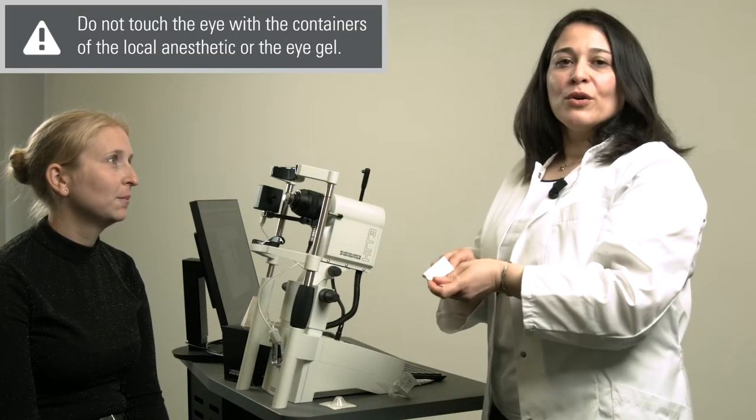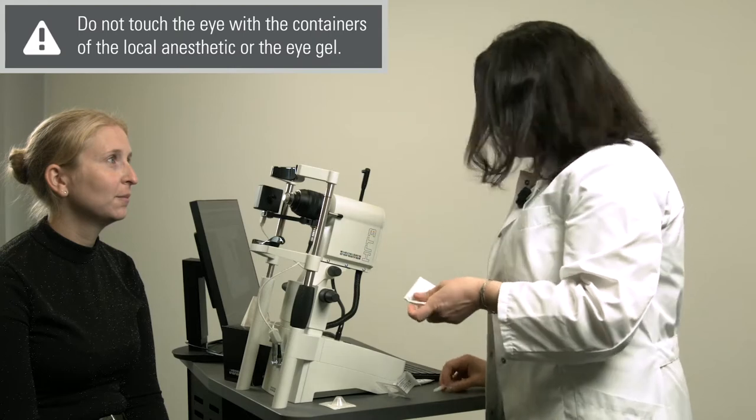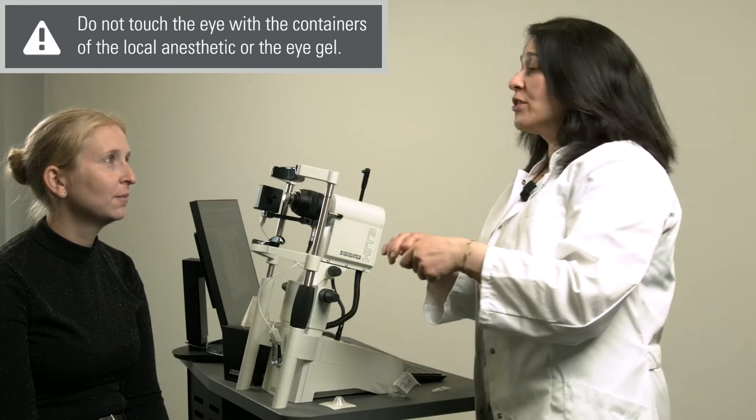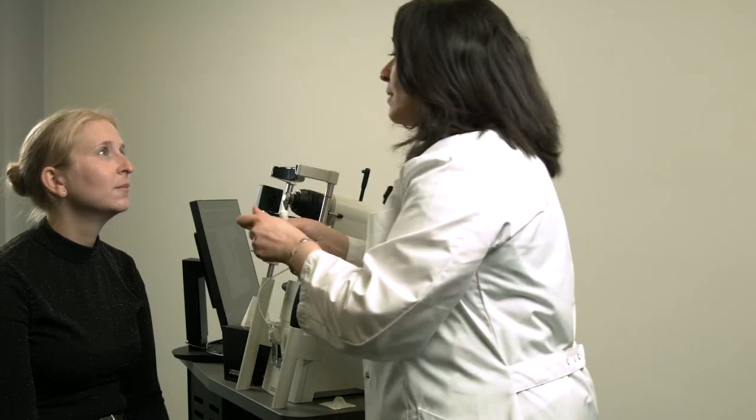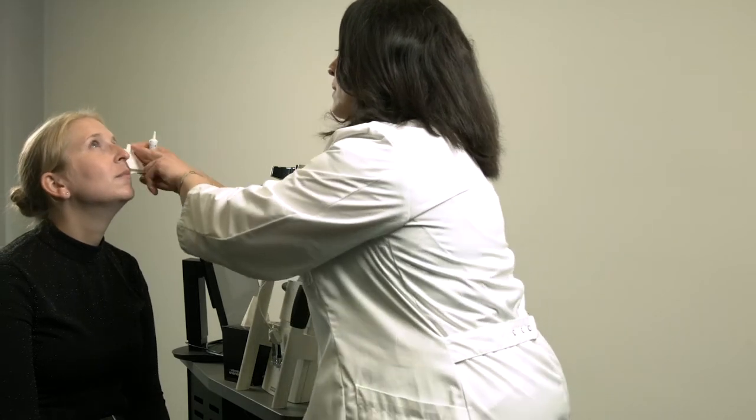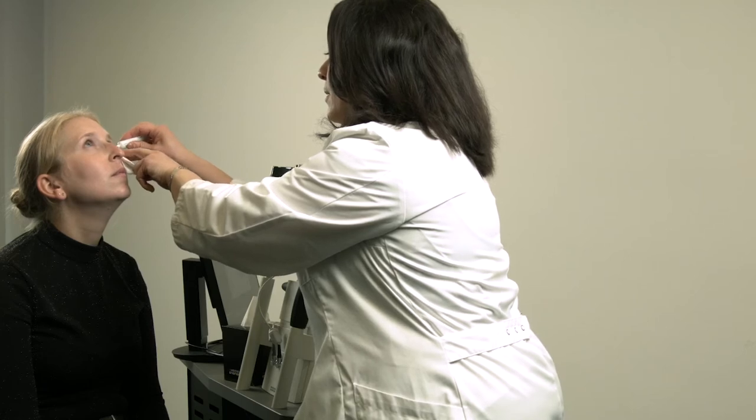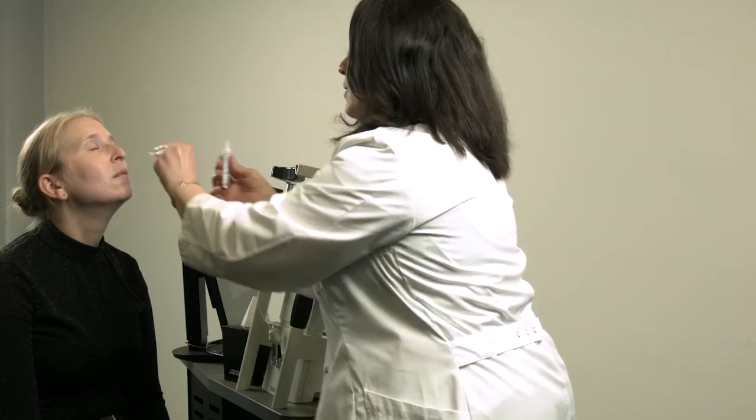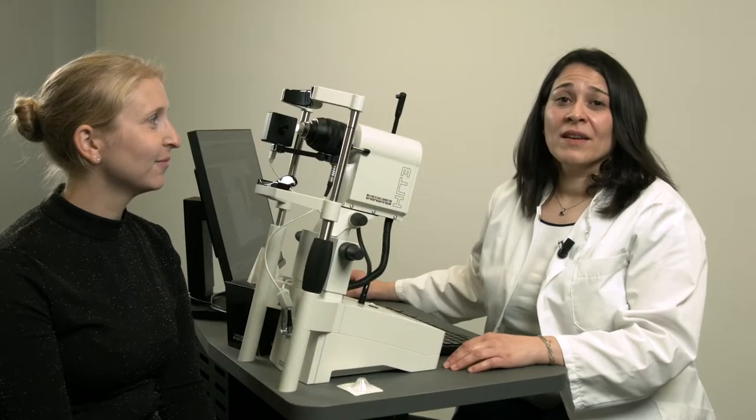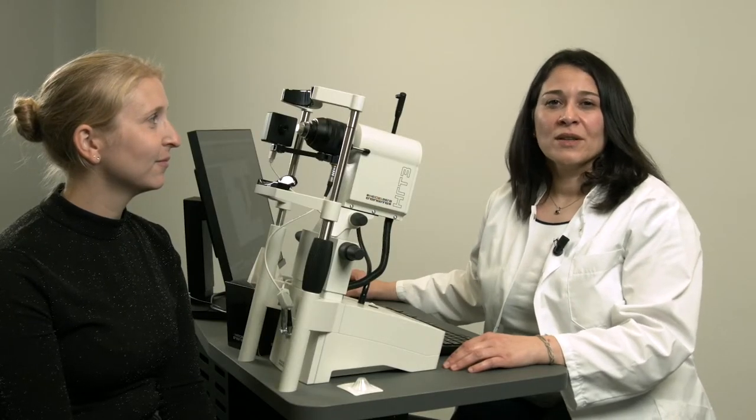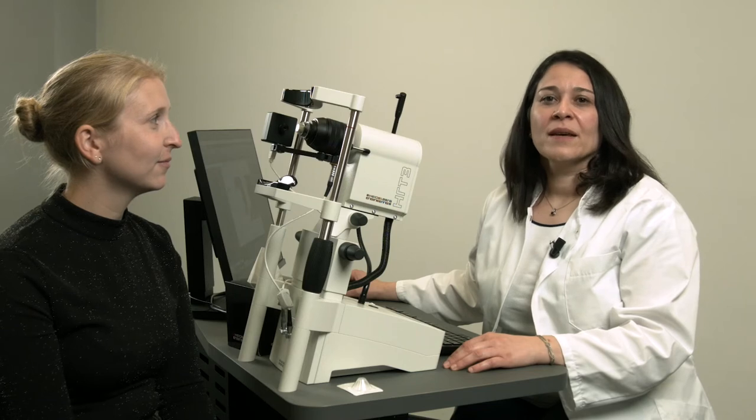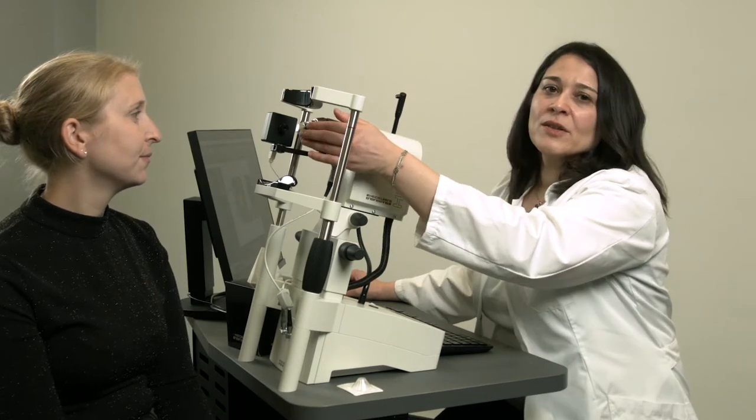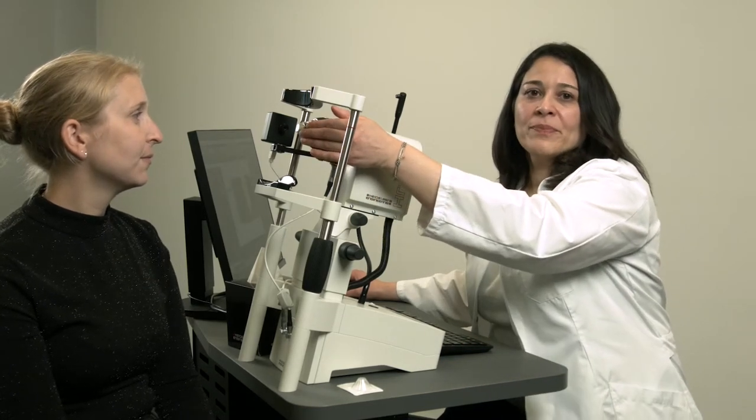We will have to apply one drop of local anesthetic to each eye to be examined. After that, I will also apply a little bit of gel into one of the conjunctival sacs. The eye gel that I've just applied to the conjunctival sac can be the same as the gel bridge between the objective lens and the tomo cap.